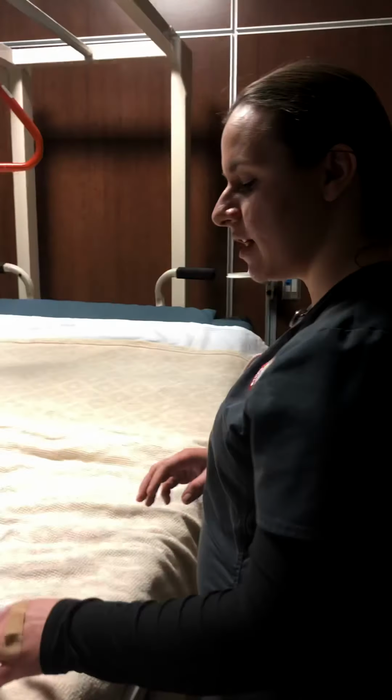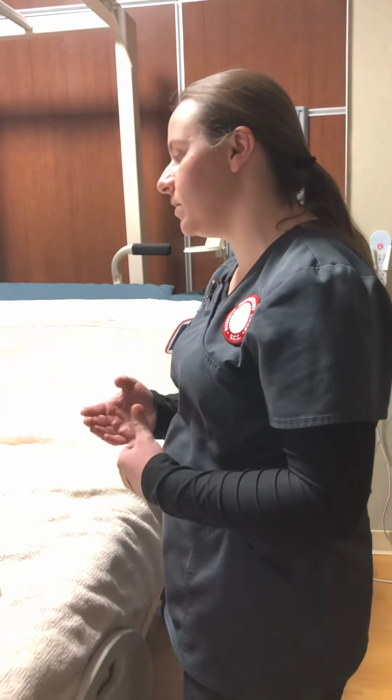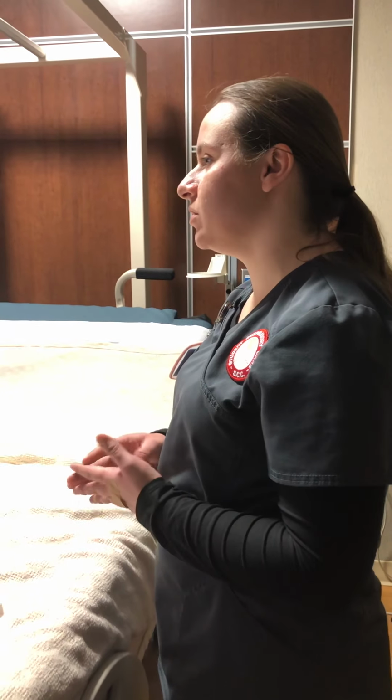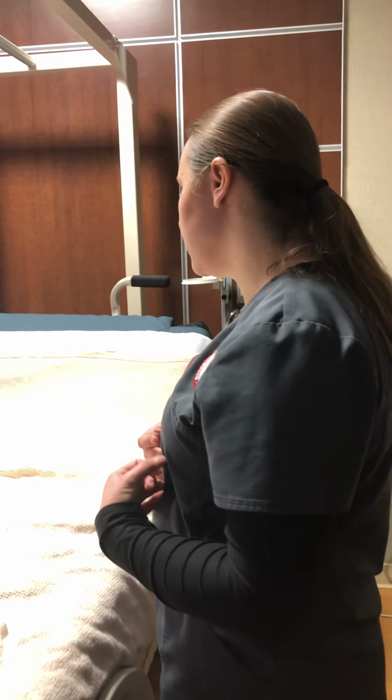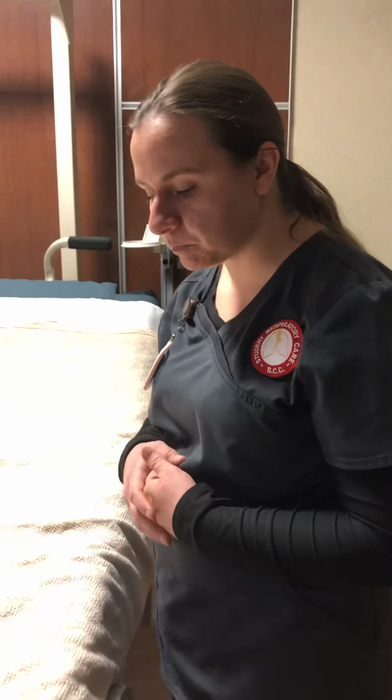So here we have an EZ PAP. So this is just going to open up your lungs. It'll help strengthen your lungs to be able to cough up any secretions that you may have, help you prevent any atelectasis, which is anything that can cause complications in your lungs that will impact your breathing, okay?